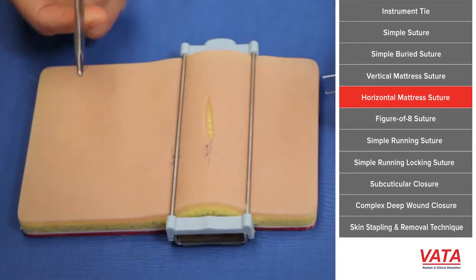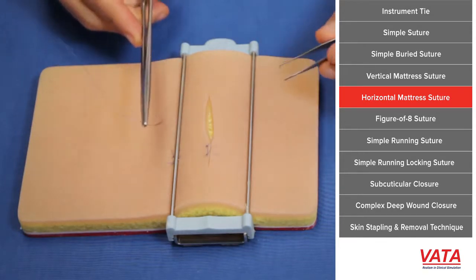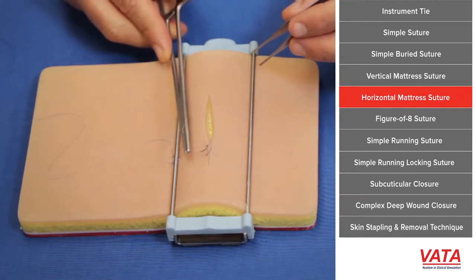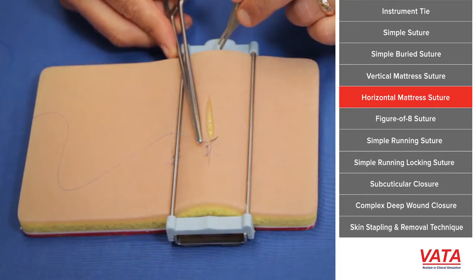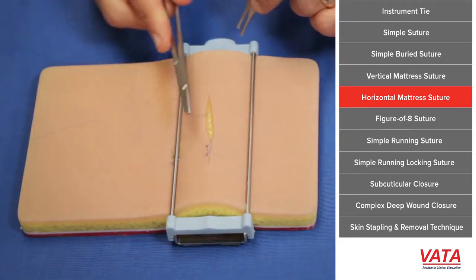This type of suture is going to be part of your armamentarium. Sometimes you can change it to a horizontal position, so these are all in the same line — hence the term vertical. Now we're going to do a horizontal mattress here. The idea is not to go near-near or far-far; take the same size bite each time. It's effectively two simple sutures combined into one suture.